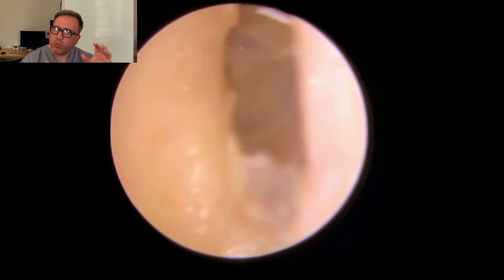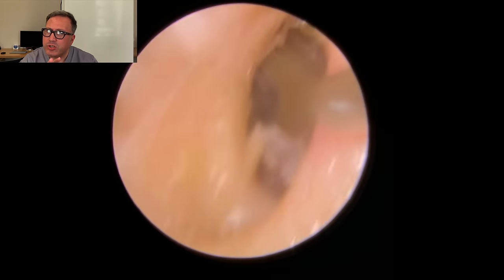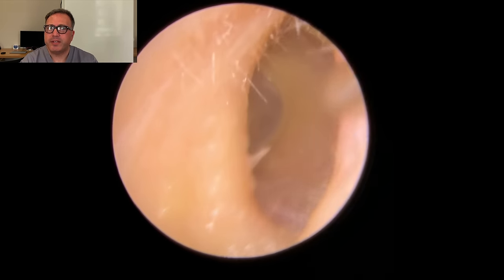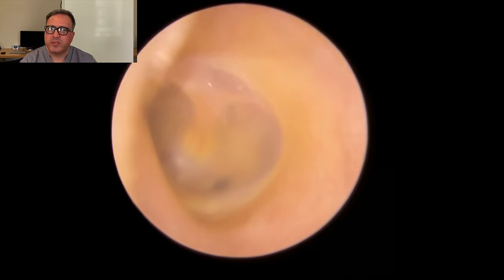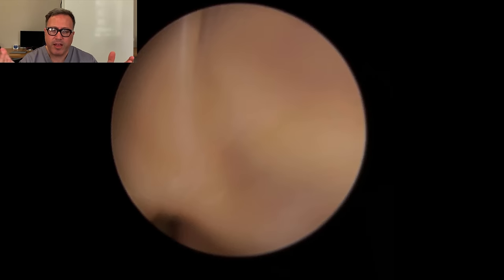I mean, obviously, with the endoscope, we can get in a little bit deeper. We can get a good look at these things, make it a bit easier to take that away out. But looking with a normal otoscope, you may not have noticed that. And the eardrum there looks lovely and healthy. So let's go back to our normal view again. There we go. So what you can see, I'll take these back off again.